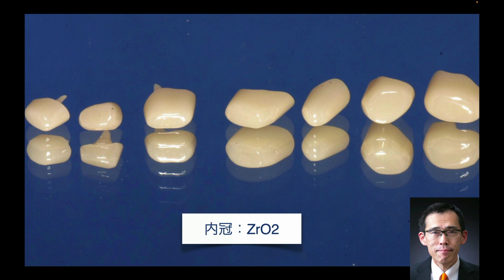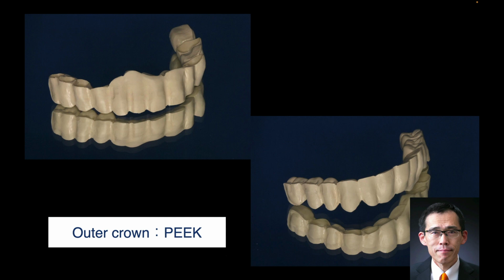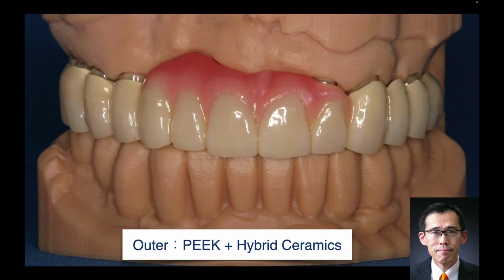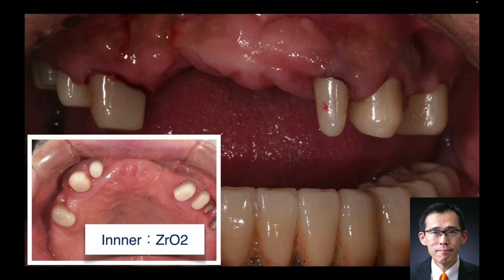You can see the zirconia inner crown and PEEK outer crown. The framework was veneered with hybrid resin, hybrid ceramics, Shofu. And this is the definitive restoration in these three models.